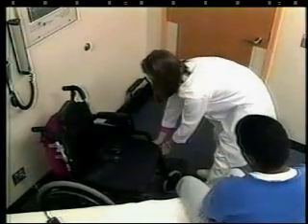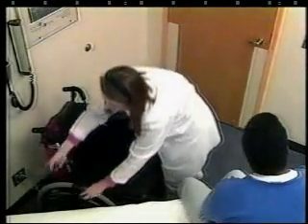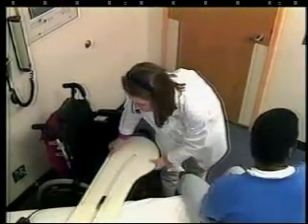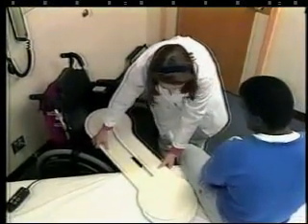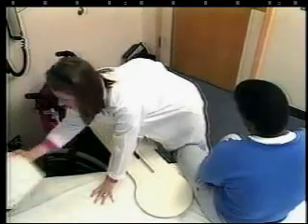Next, use all means at your disposal to make the transfer as level as possible. If a bed which can be raised or lowered is involved, please use that feature to your advantage. If a slight difference in height still remains, a towel or cushion can be used to raise the appropriate surface a few more inches. If you need a second cushion to achieve this, by all means use it. Making the transfer level is very important.